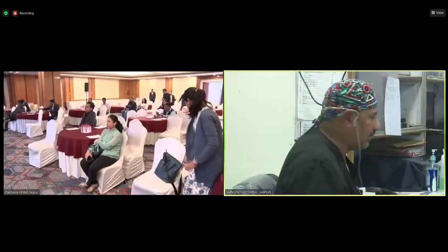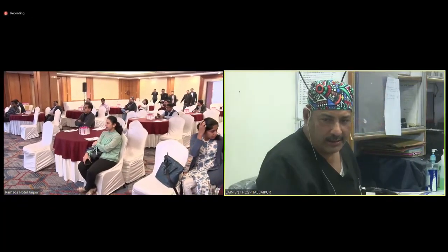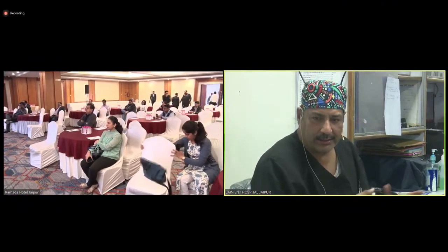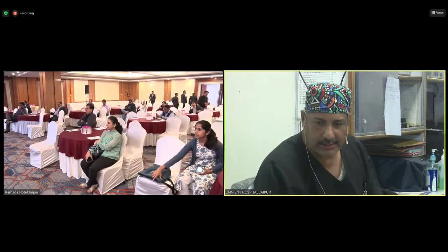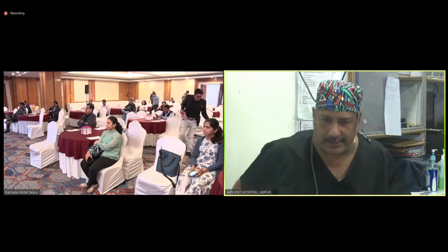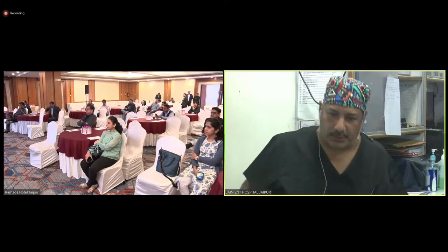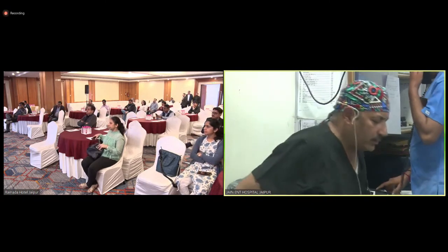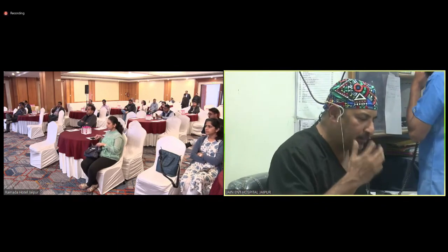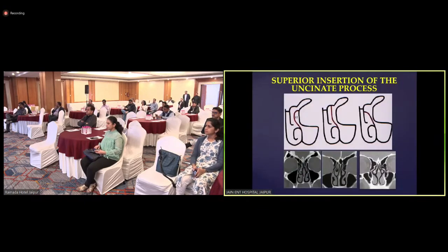So we are here to continue on what we did yesterday in the surgical session with a little more advanced cases. The first case we are taking is a revision frontal sinus surgery requiring some extended approach. So regarding the frontal sinus, I want to just share certain things with you. Before we move on to the surgical part, are you getting the PPT?